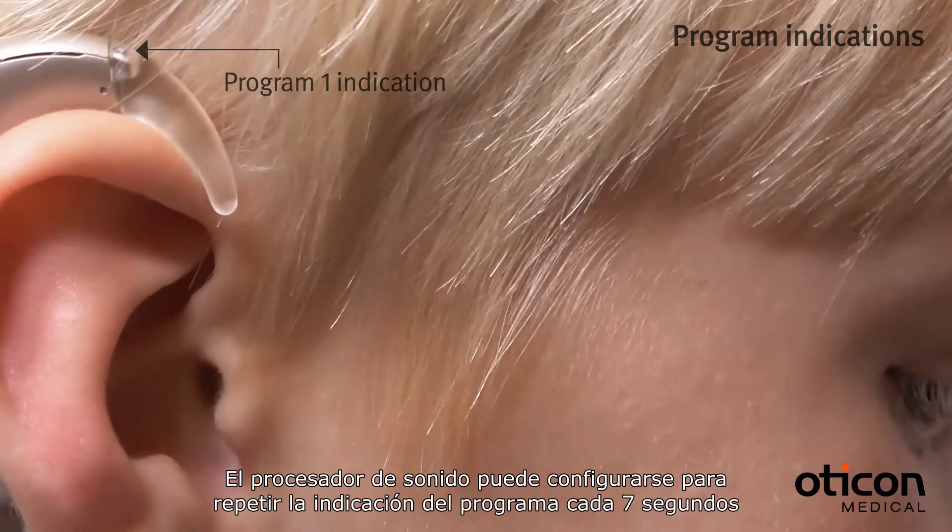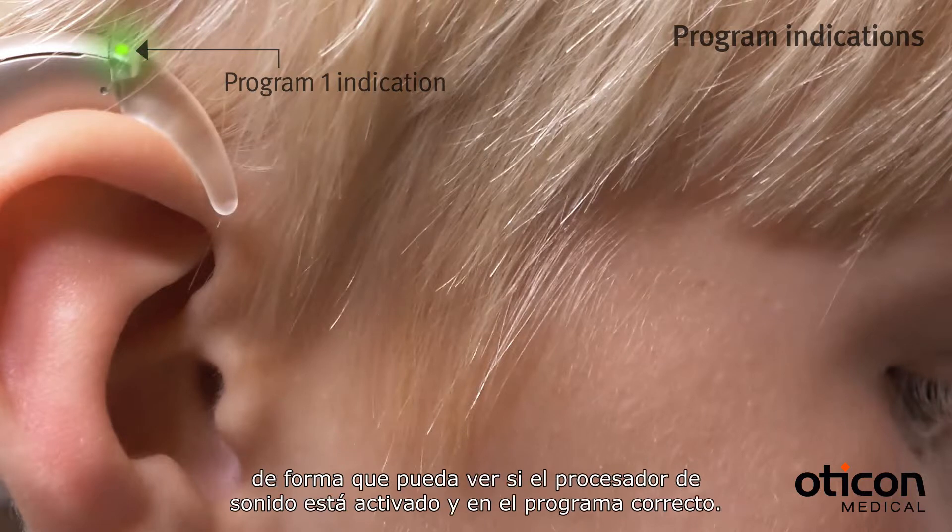The sound processor can be configured to repeat the program indication every 7 seconds, allowing you to see if the sound processor is turned on and in the right program.